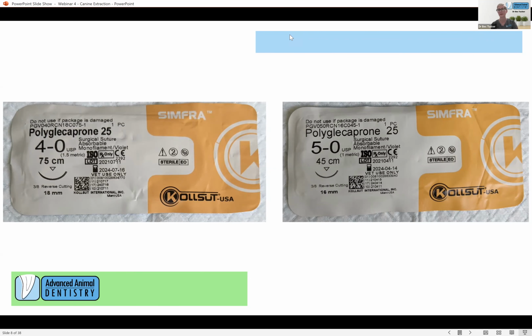I guess the Monocryl, on the reverse cutting needles, we've been advised is no longer available in a dyed suture, just a clear, which I struggle with quite a lot and prefer dyed. And there's word coming through that we're going to struggle to get the Monosyn as well. So we've tried this. I was actually really happy with the needles. It stayed sharp, probably more so than the Monosyn. It was actually a little bit nicer. Knot security was good. So all in all, we're pretty happy with this.